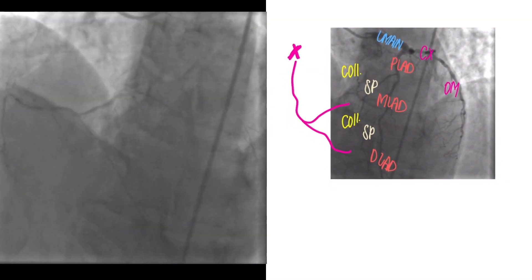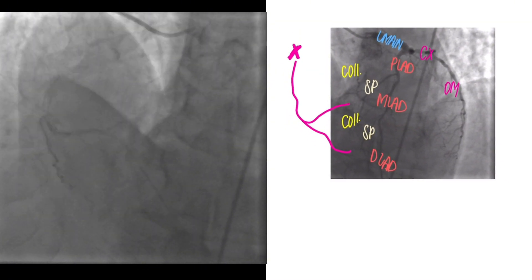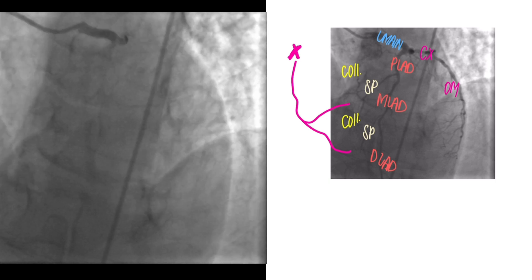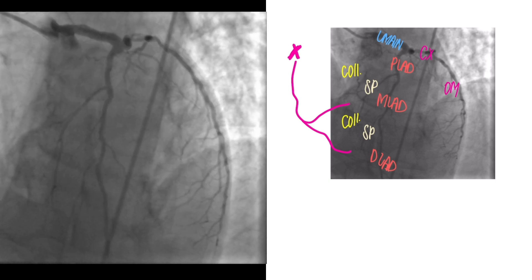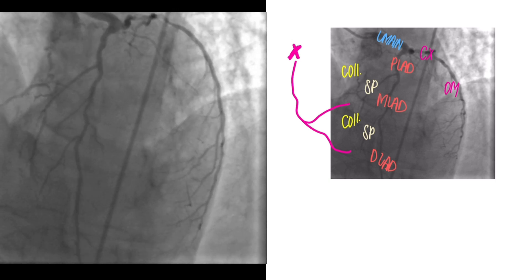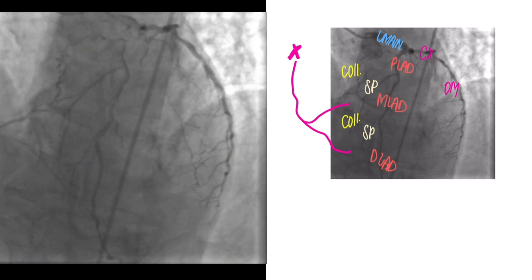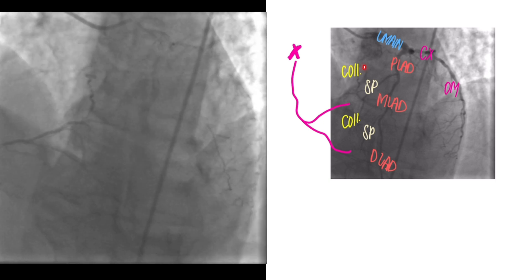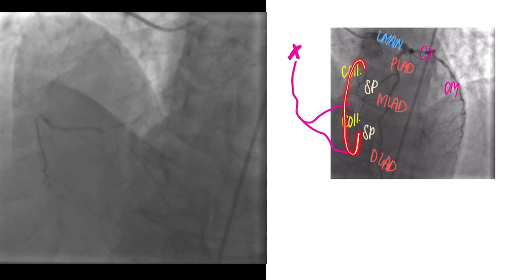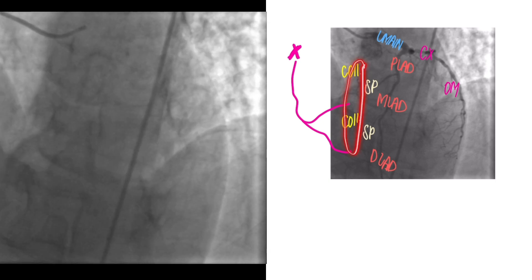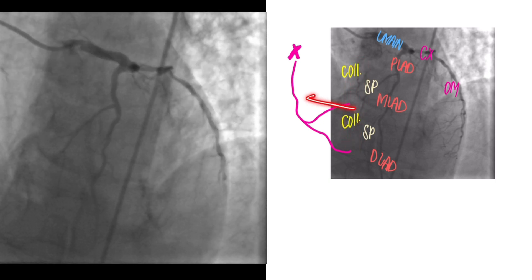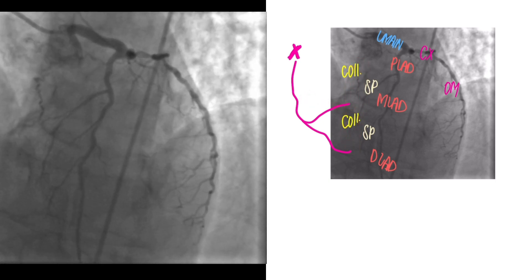When you start to see vasculature not normally where it's supposed to be, it's important to pan and follow it to see where it's going.